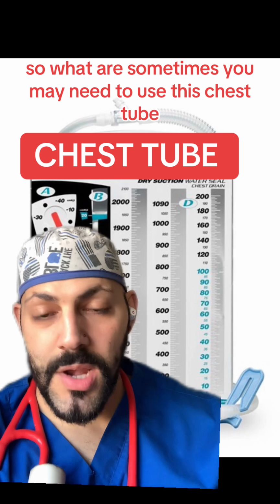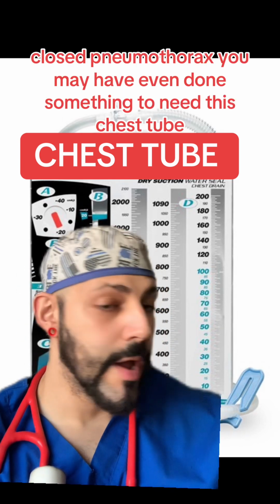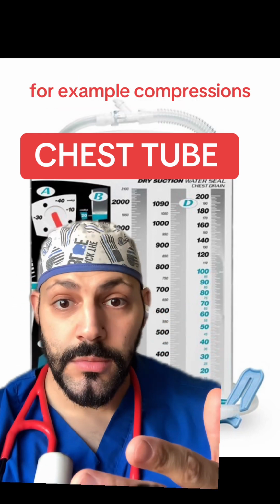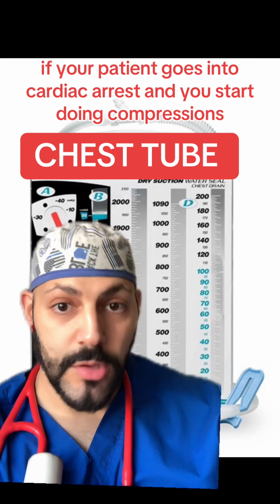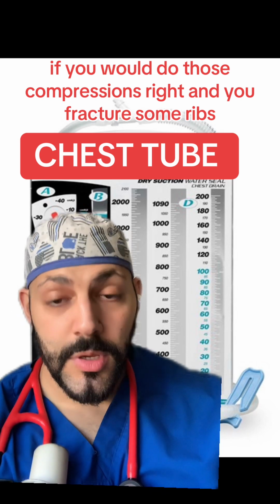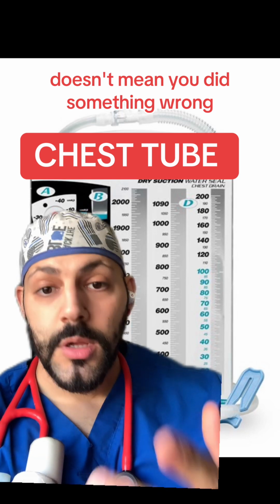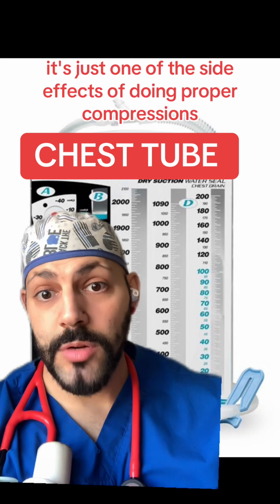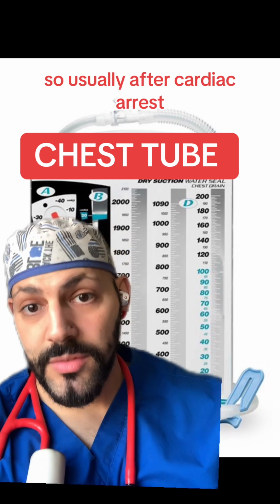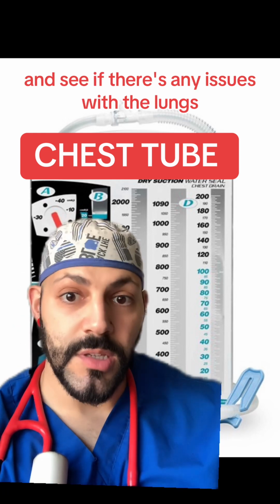So what are some times that you may need to use this chest tube? You may have an open pneumothorax, a closed pneumothorax. You may have even done something to need this chest tube. For example, compressions. If your patient goes into cardiac arrest and you start doing compressions, if you were doing those compressions right and you fractured some ribs, you may have punctured a lung and you may need to place a chest tube. Doesn't mean you did something wrong. It's just one of the side effects of doing proper compressions. You crack ribs and may need a chest tube. So usually after cardiac arrest, they'll do a chest x-ray to see if there's any rib fractures and see if there's any issues with the lungs.